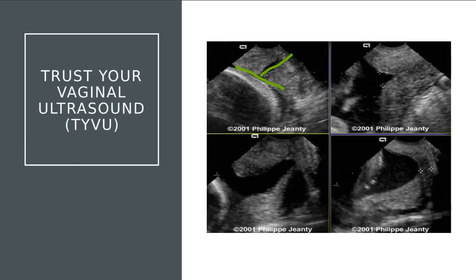Our next one is going to be Y. So here we have our Y shape. Now we're spreading a little bit more with our cervical internal os than we were with the T, but we're not really shortening too much yet. We're not really thinning too much. Now we get into the V and the U, and this is where we get a lot of effacement.